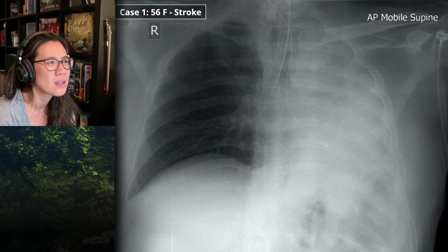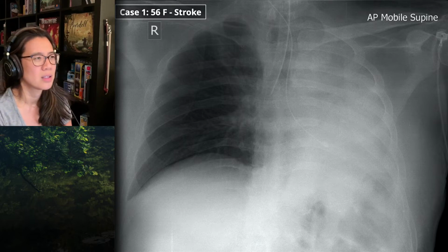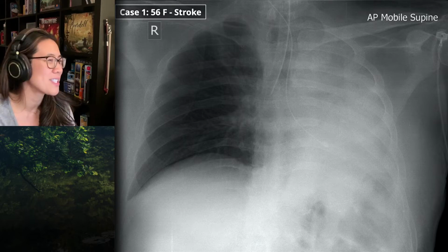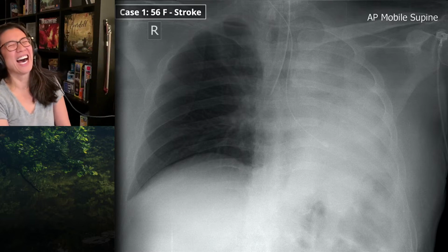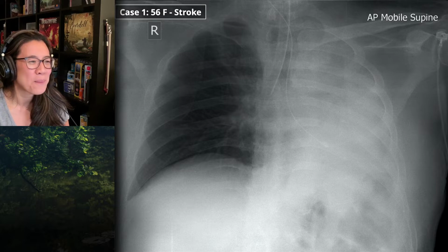So I suspect it's actually not in the left main bronchus, and I suspect it's probably in the esophagus/stomach, and that's just the top gastric fundus is probably up that high, and you can't see it. Okay. So, I said 80%. Small 80%. Okay. So this is a small white hemithorax. Case 1. Next case.